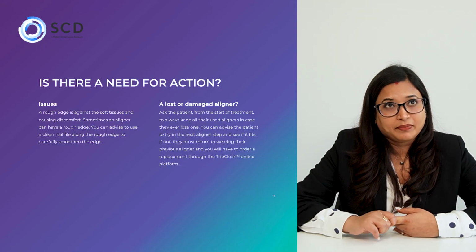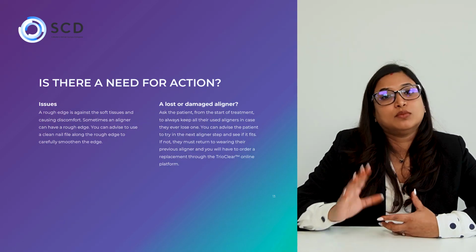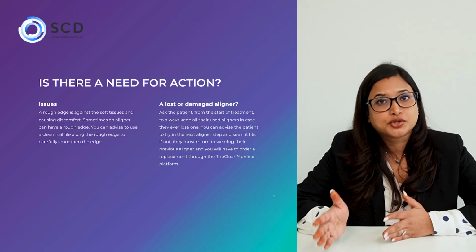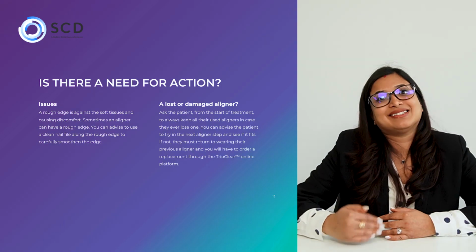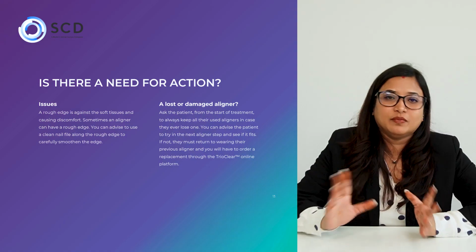Having said that, we increase the gingival coverage in our aligners because that gives us more surface area to cover to bring about a movement. And it gives a more controlled movement. If you reduce it to just a scalloped cut up to the gum, it might not bring about the same solution, but there are ways to work it out.